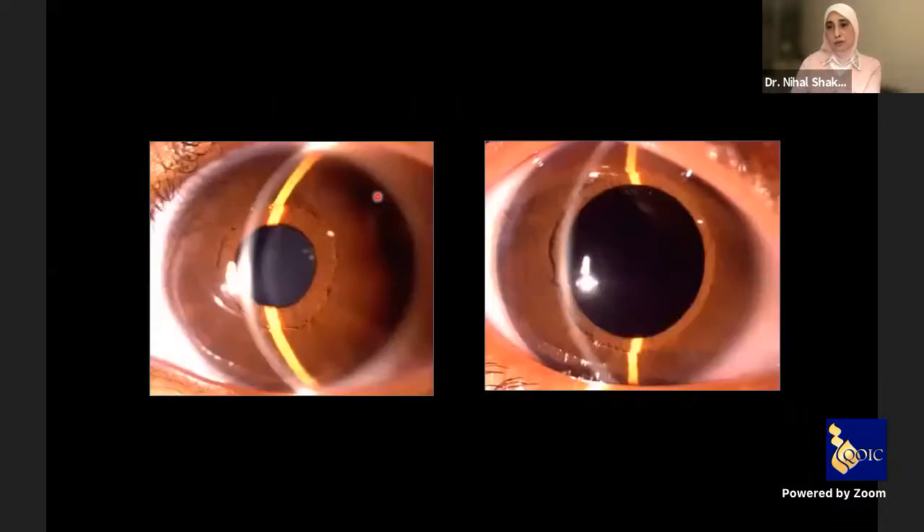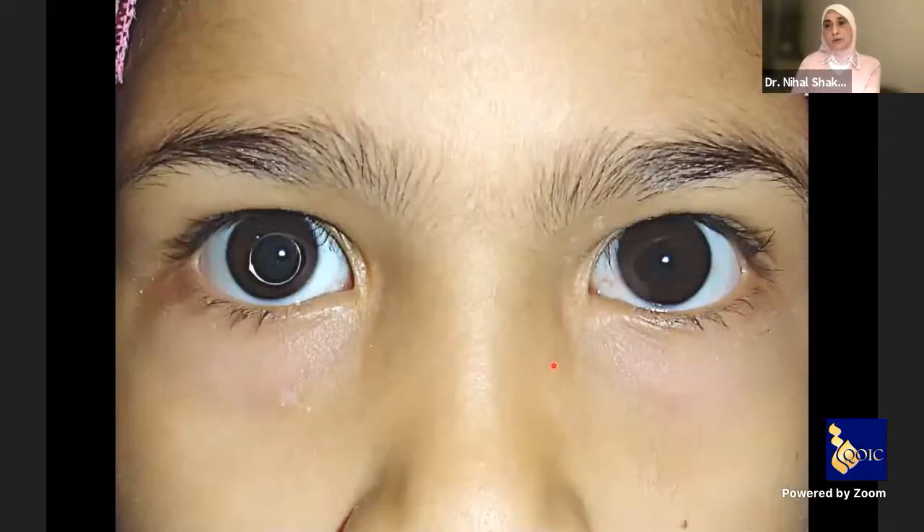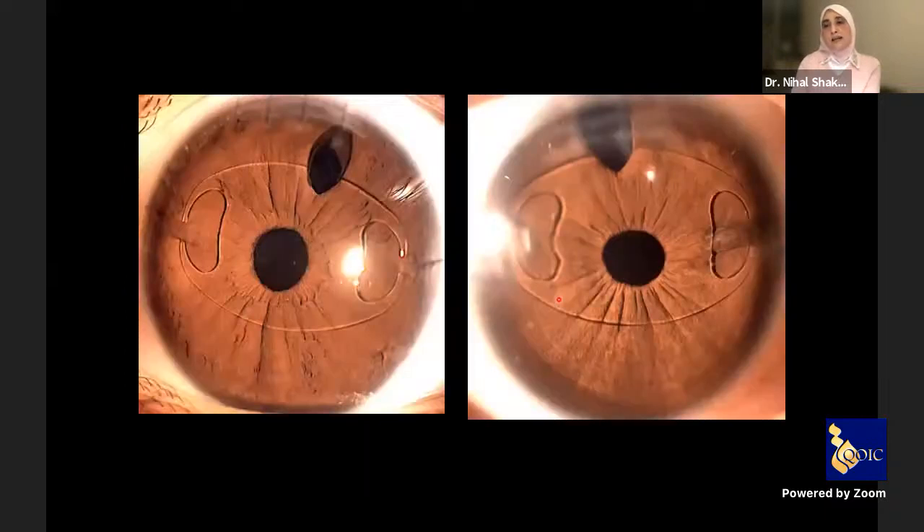Here at conclusion of surgery: immediately after, we have a deep anterior chamber and we fit the babies with aphakic spectacles. In cases of older children — such as this case with a dislocated anterior microspherophakia and a subluxated one — we can implant an iris claw lens as a secondary procedure.